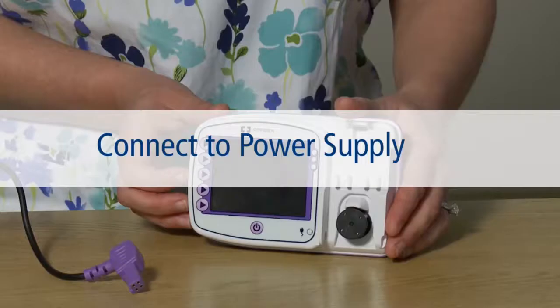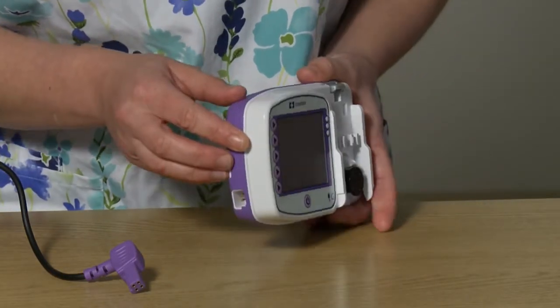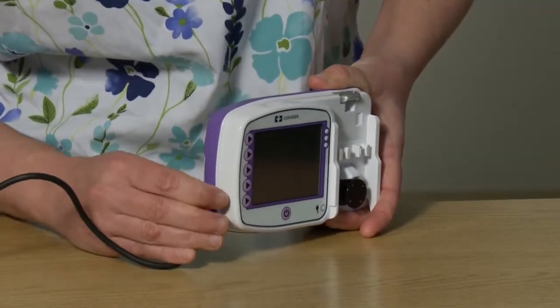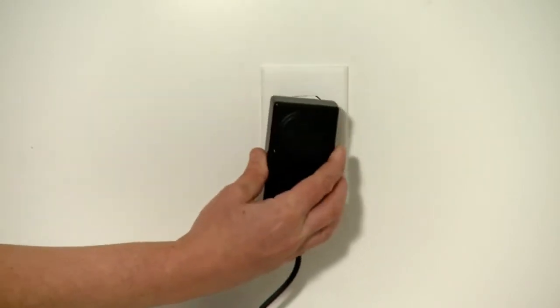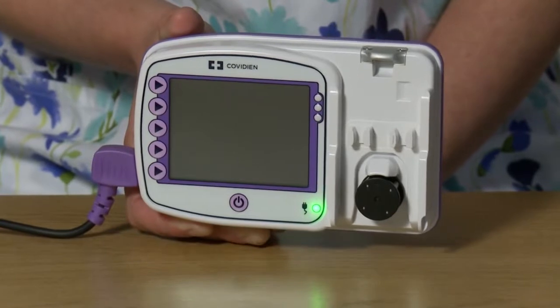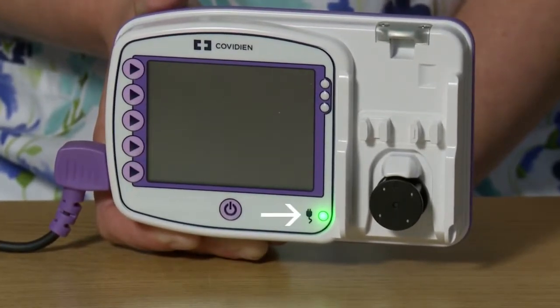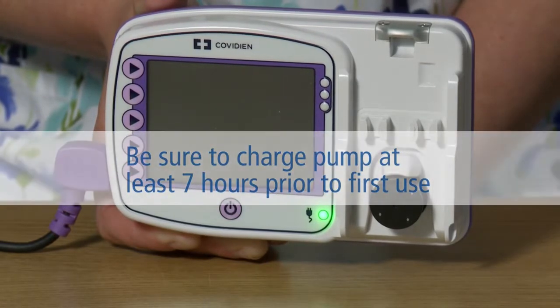System setup. Before you begin using the pump, you will need to be sure that it is fully charged or connected to a power supply. Plug the power adapter into the power adapter port located on the left side of the pump. Plug the other two-prong end of the power adapter into a nearby AC outlet. Check to see that the AC indicator light is on to confirm that the pump is receiving power from the wall outlet. Be sure to charge the pump for a minimum of 7 hours before initial use.